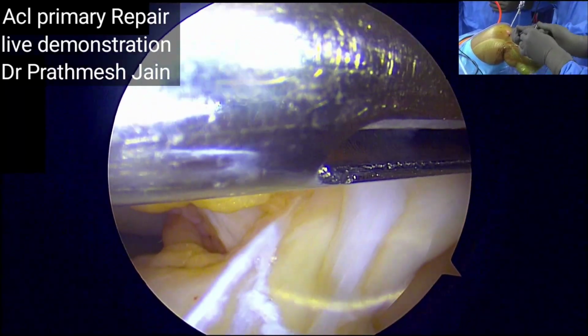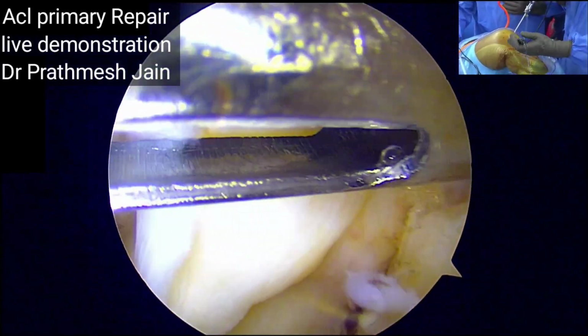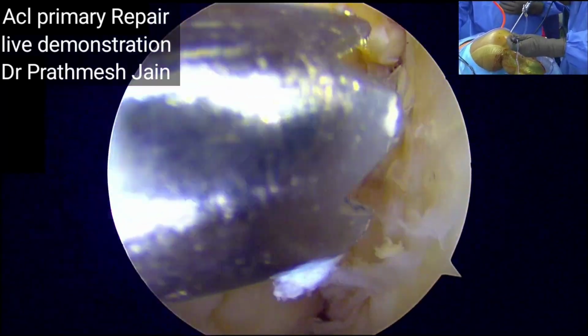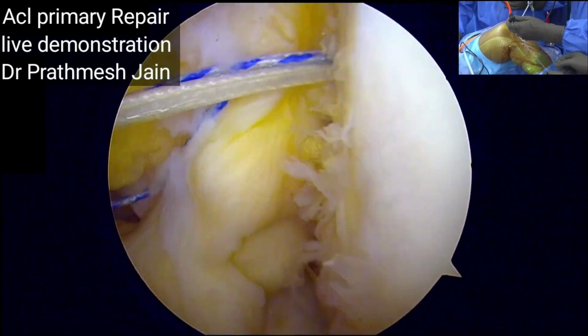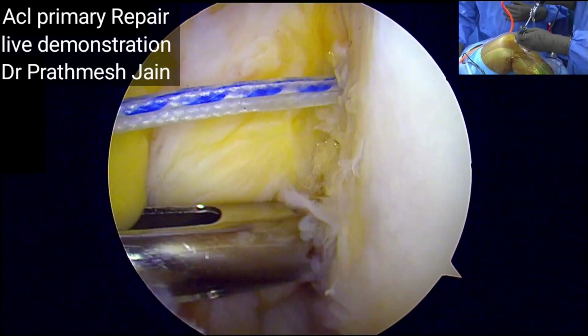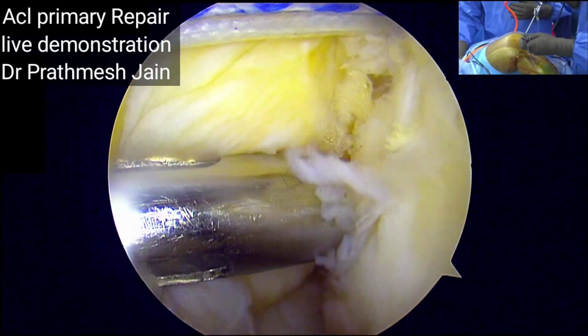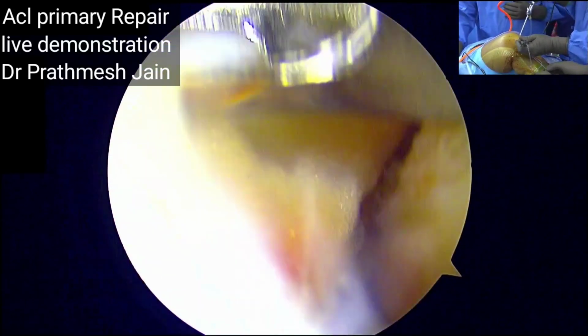Now this anchor is very specific. It's an all suture anchor. It's a 1.7 mm drill. The suture size is very small. It is a 0 number suture, which is a very small or low profile sort of suture. We'll do a gentle seesaw maneuver of the suture to just lock them into their place.